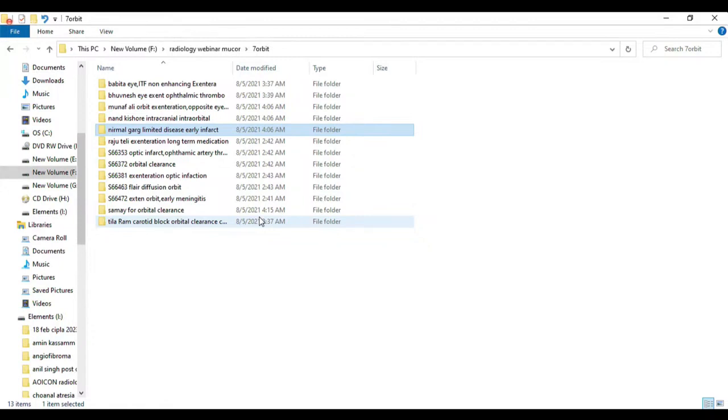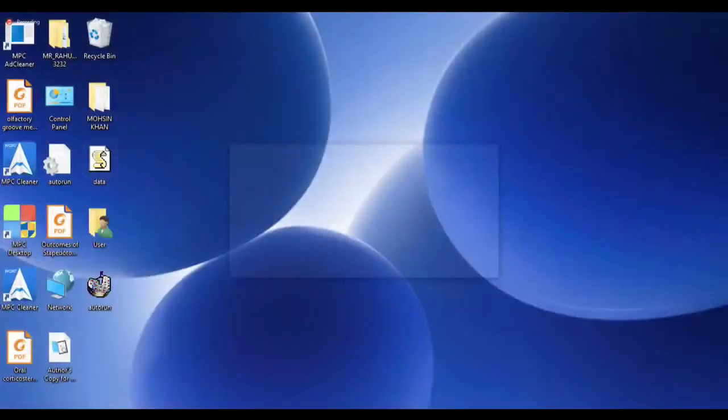One case you can show. Just for the rehearsal, what we had done yesterday. Which case is ready, sir, now? All 4 cases are going on simultaneously. We had 12 cases today, so we are finishing them.